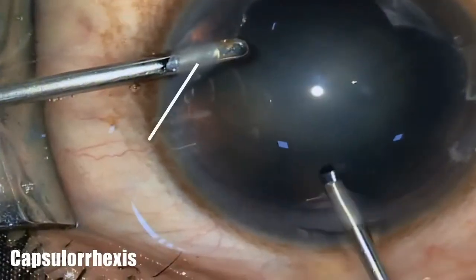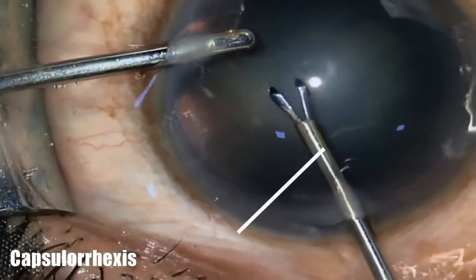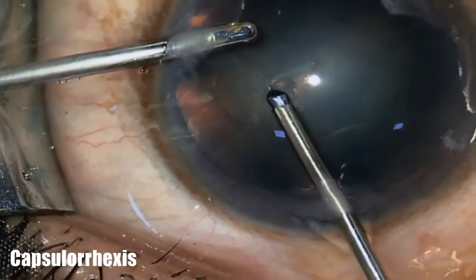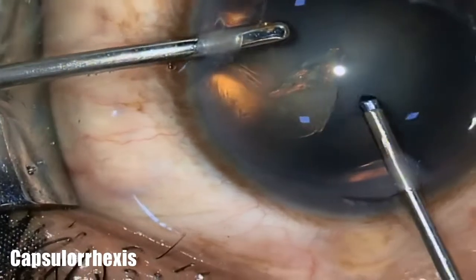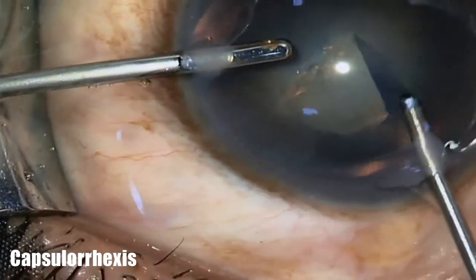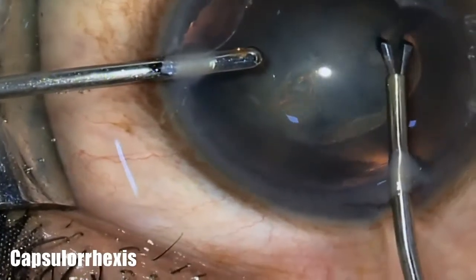Here comes the real challenge of visco-less phaco surgery: the capsulorhexis. After stabilizing the globe with the left hand, Micronexus forceps are used to perform the capsulorhexis, keeping in mind the turbulences and fluid currents of continuous irrigation in the anterior chamber.